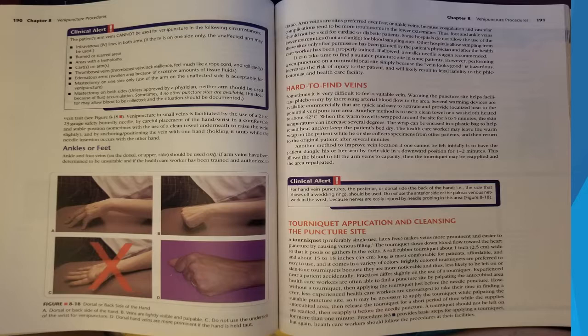It can take time to find a suitable puncture site in some patients. However, performing a venipuncture on a non-traditional site simply because the vein looks good is hazardous. It increases the risk of injury to the patient and will likely result in legal liability to the phlebotomist in a healthcare facility. Hard to find veins. Sometimes it's very difficult to feel a suitable vein.